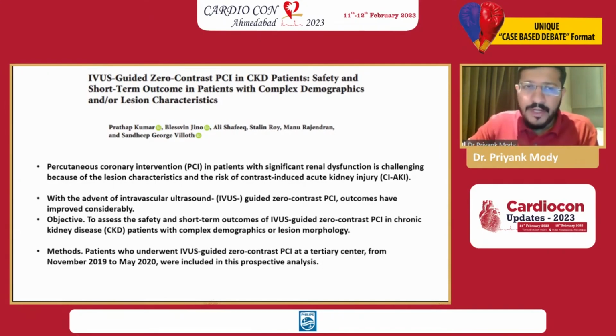And why did I decide to select this study? To quote my point, PCIs in patients with significant renal dysfunction is challenging because the risk of AKI is there. With advancement of IVUS, we can go towards zero contrast angioplasty.